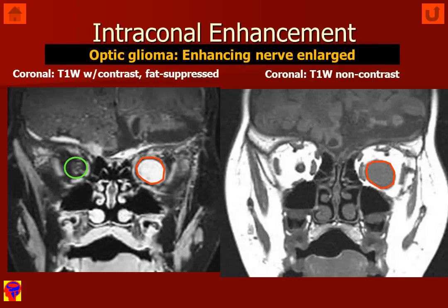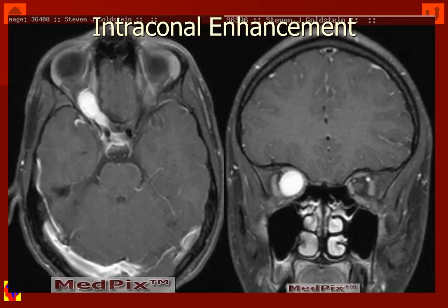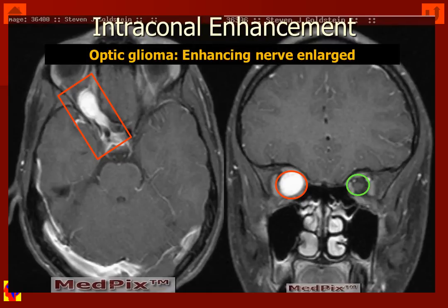This is most consistent with an optic nerve glioma. A third example of optic nerve glioma shows us in the red rectangle an abnormally enlarged optic nerve with abnormal enhancement on the right side, and the coronal image demonstrates the intraconal enhancing mass lesion. The normal optic nerve in the green circle does not show contrast enhancement.